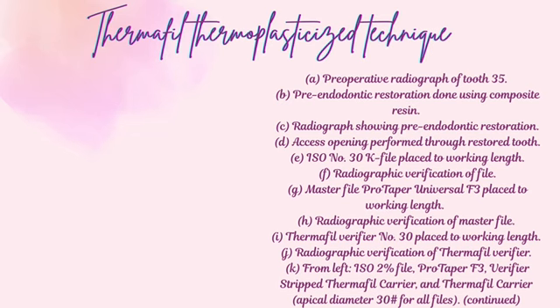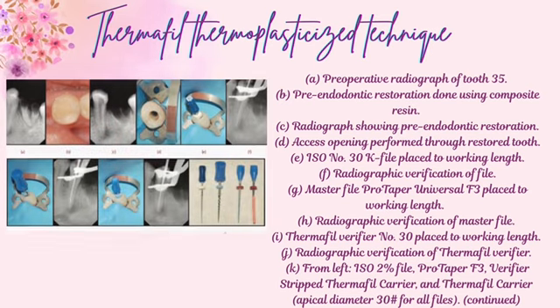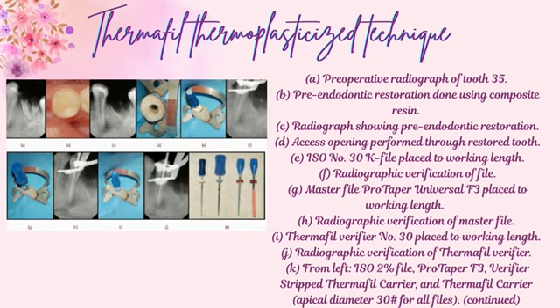Thermafil thermoplasticized technique. The pre-op radiograph of tooth 35 is taken. Pre-endodontic restoration done using composite resin. Radiograph shows pre-endodontic restoration. Access opening performed through the restored tooth. ISO number 30 K-file placed to working length.